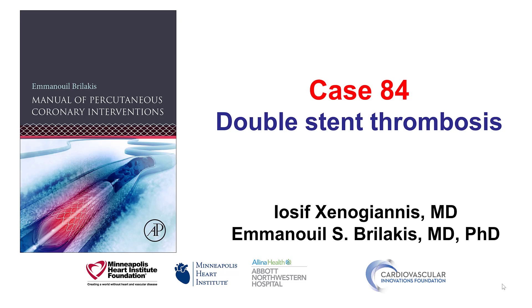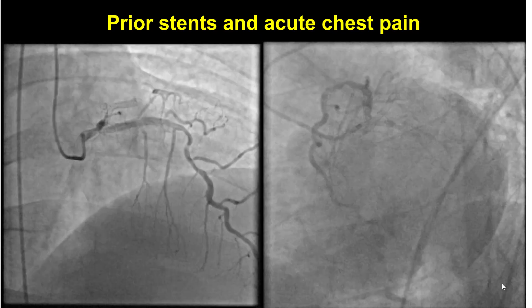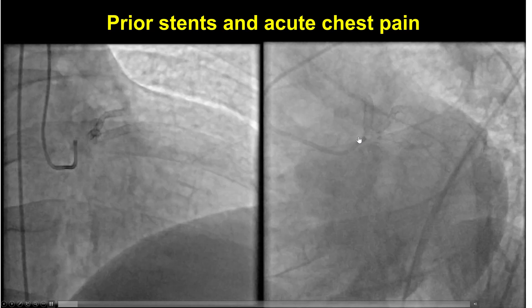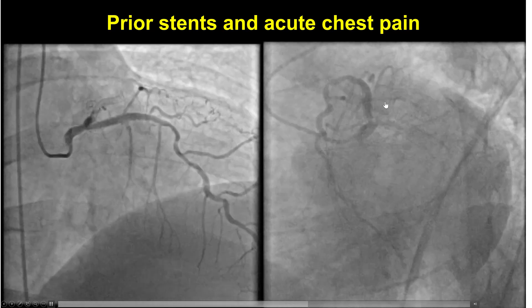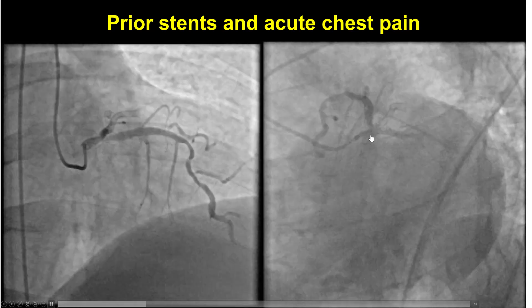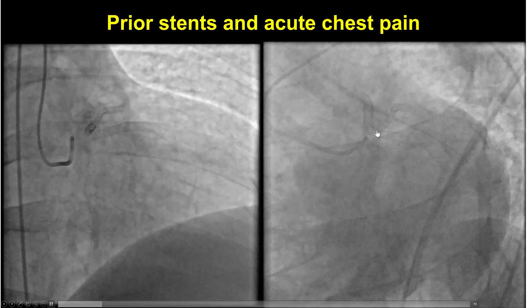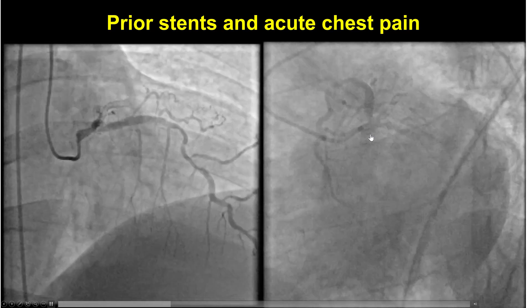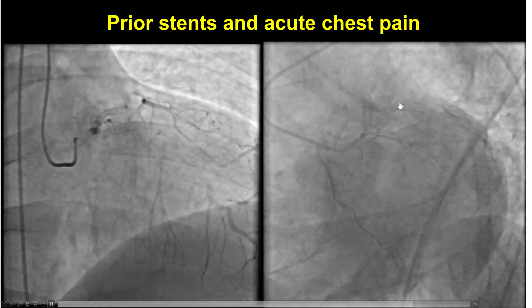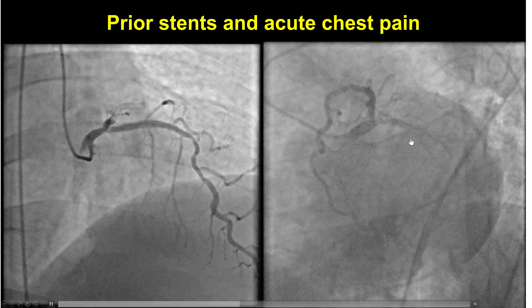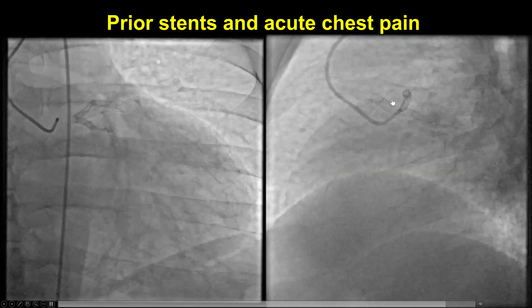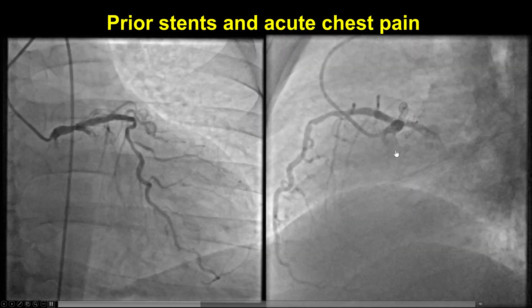This is a case of a patient who developed stent thrombosis in two vessels. The patient had previous stenting of a left main trifurcation with a large ramus, circumflex, and LAD, and presented with chest pain and ST segment changes. Emergency angiogram demonstrated thrombosis of both the ramus stent and the circumflex stent. You can see in different projections the filling defects inside the circumflex stent as well as inside the ramus stent.